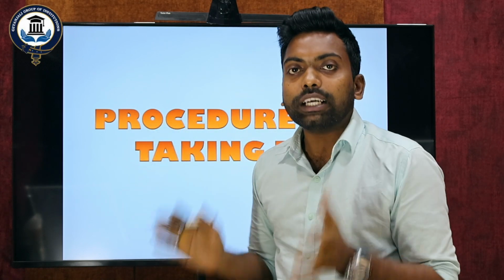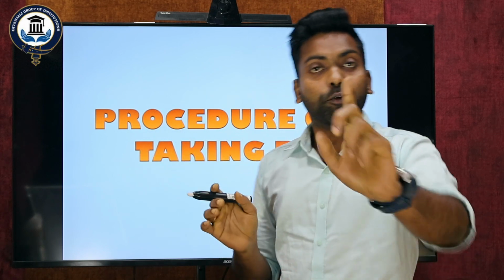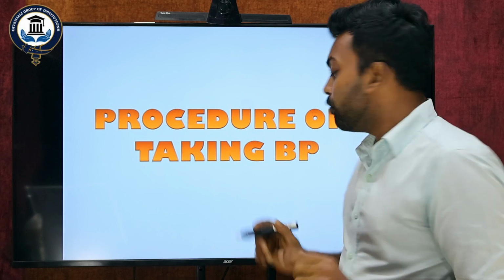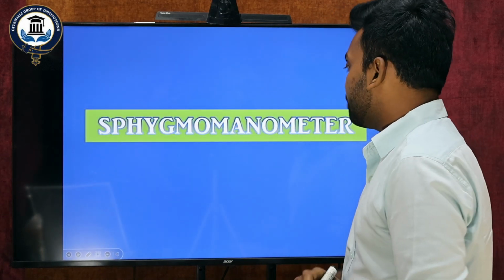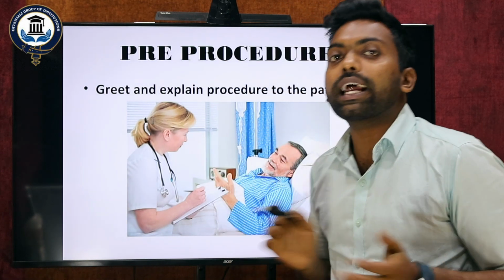As a medical student, as a nursing student, we must know the exact location, the exact step-by-step activities, and the exact procedure of measuring blood pressure. That I am going to discuss today, and you will get the exact meaning today. I am going to explain the procedure using the sphygmomanometer.